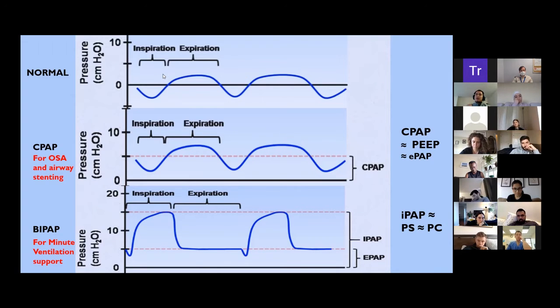So if that patient already has a very high minute ventilation without effective shunting, and you put them on BiPAP, you're going to be giving them way too much tidal volume, and now the patient will develop an even worse respiratory alkalosis. So if you want to bypass the inspiratory support and just provide them with PEEP and oxygen, then CPAP becomes more effective in that phenotype. That's a little bit more advanced, but I know that for many of the seniors, it's going to ring a bell because we see many COVID patients presenting with this phenotype.